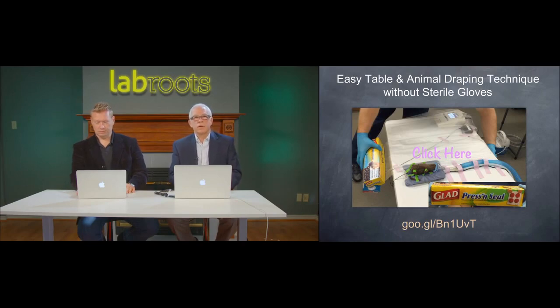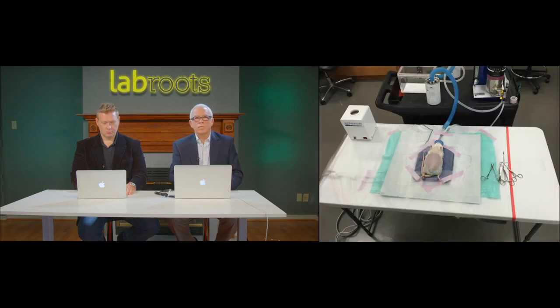But right here in this video, we were intending to show you a very easy method of draping the entire table with a presealed drape without having to use aseptic technique. Very easy. A lot of investigators will have a sterilized tiny surface of a towel, something like that, and they get all kinds of cross-contamination because they haven't extended the sterile field. So I'm going to go into the next slide. We have a total of five videos. Hopefully the other ones will play.